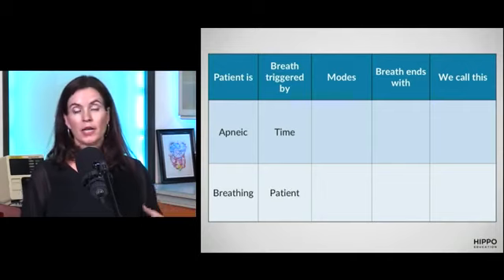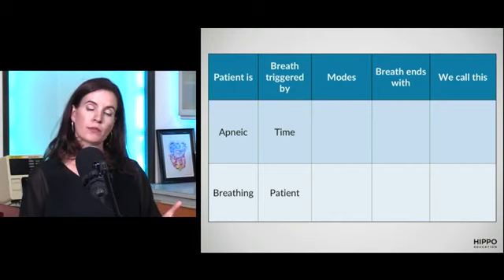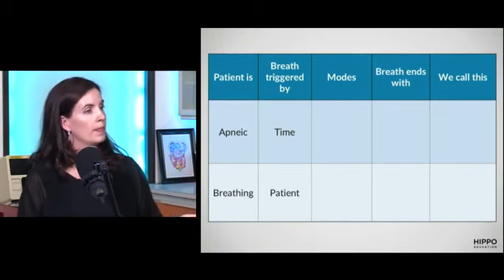Whereas if your patient is awake and breathing, they will trigger the breath themselves. They will start to inhale, the vent registers this pressure deflection, and then will help them by delivering a breath. So really it's like a difference between a paralyzed patient and a non-paralyzed patient. Exactly. Or a dead patient and a not dead patient. Yes, and hopefully if you're ventilating them for a long time, they're at least partially alive. Exactly. So the apneic, they just can't do the breath by themselves.